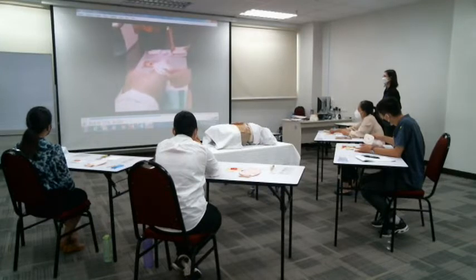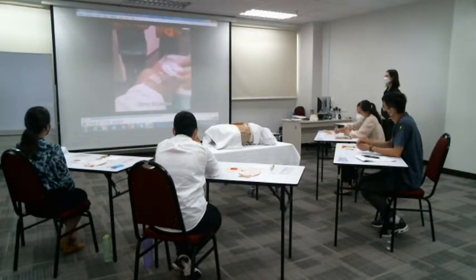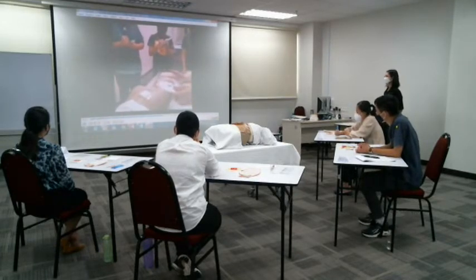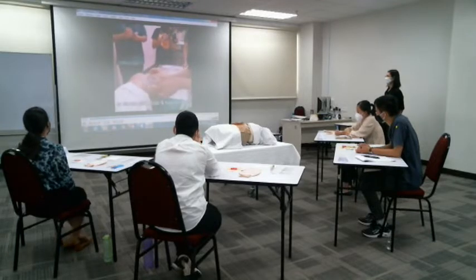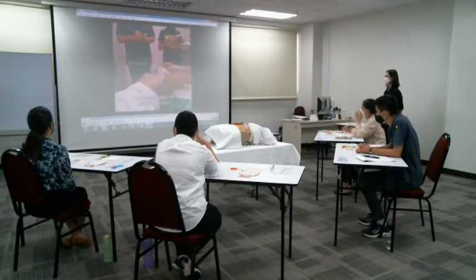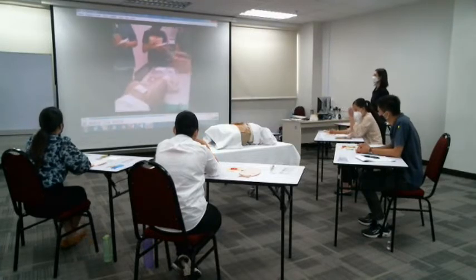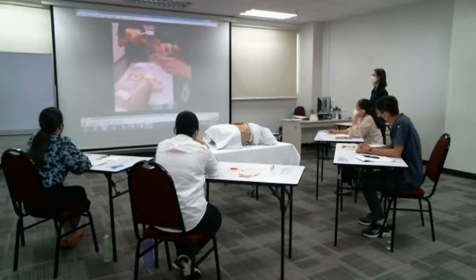And after that I take a wet tissue. Because of functioning stoma, having presence of stool. So before that, actually, I also check whether the stoma is clean, moist, okay, healthy, and functioning with presence of flatus or presence of stool. And the peristomal skin, whether there is any excoriation.